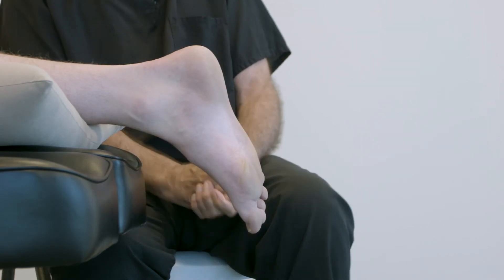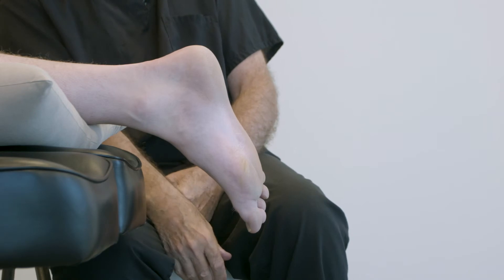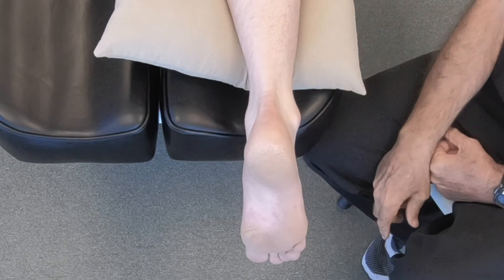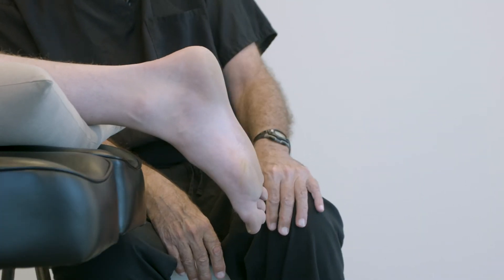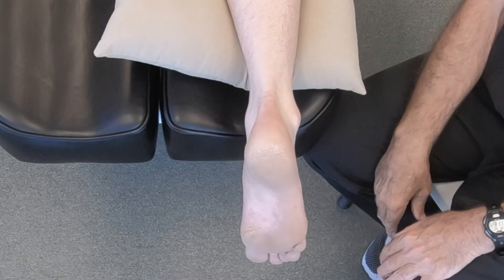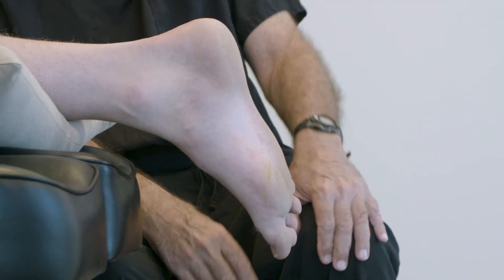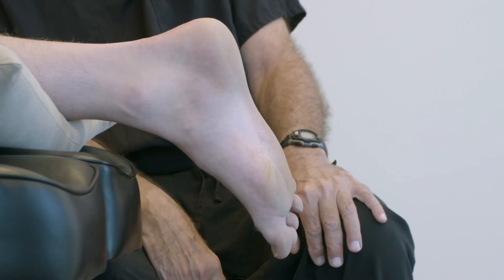With the patient in this prone position, you do not want to take a scan with the foot just hanging in space. You can see the subtalar joint is inverted or supinated and the mid-tarsal joint isn't loaded. If we take a scan of the foot like this, we're going to capture this varus deformity of the heel and an improper alignment of the mid-tarsal joint that will pretty much doom the orthotic to failure, in my opinion.